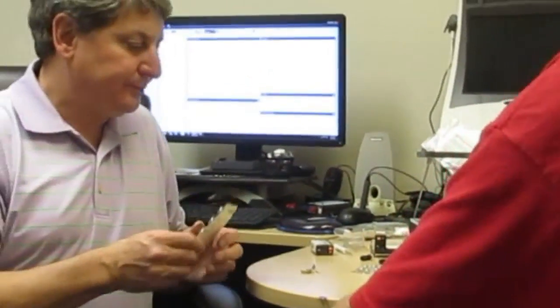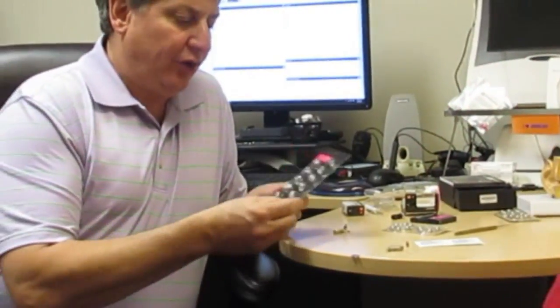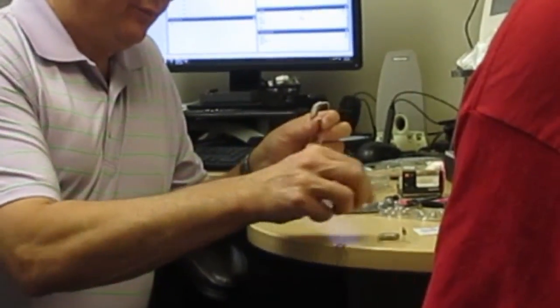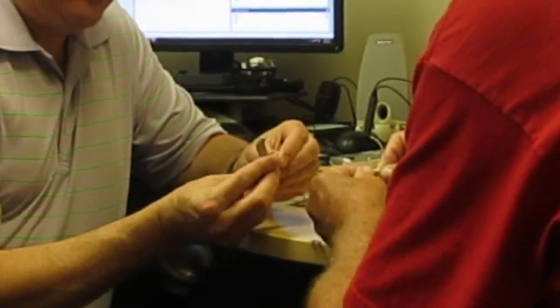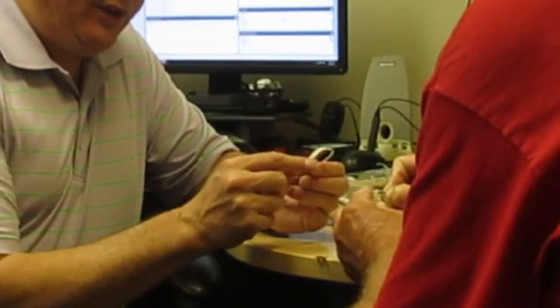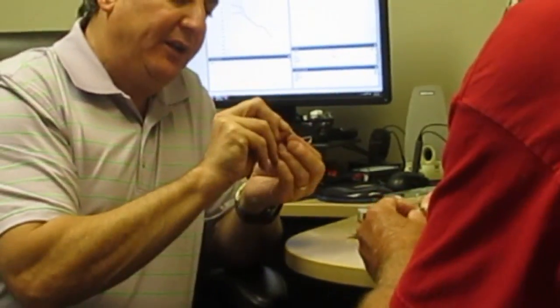Would you like to put this battery into that hearing aid? Now these are called domes — the domes are a little rubber piece that will fit on top of this. You can put that one on there as I do it, because you'll need to change these from time to time. You just pull it off, but when you put a new one on, there's a little hole on the bottom and you just kind of guide it into the hole and then press it onto the tip of the speaker. You're spreading that rubber tube which is smaller than the tip of the speaker.